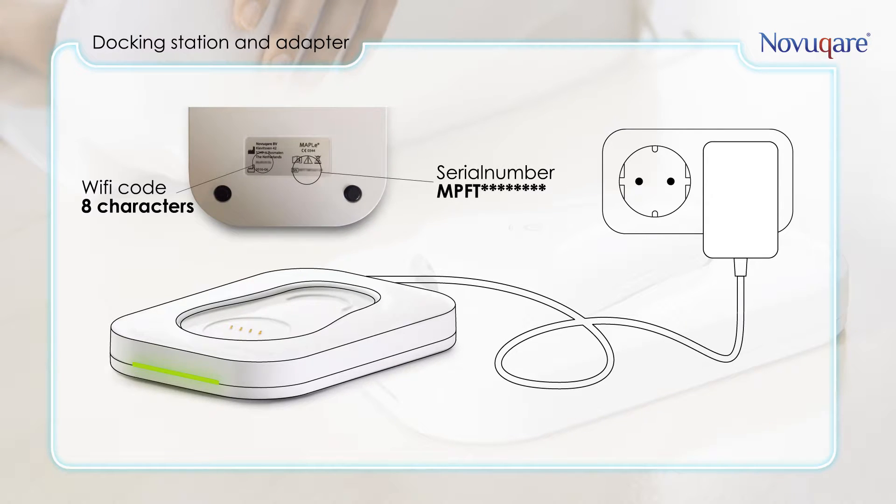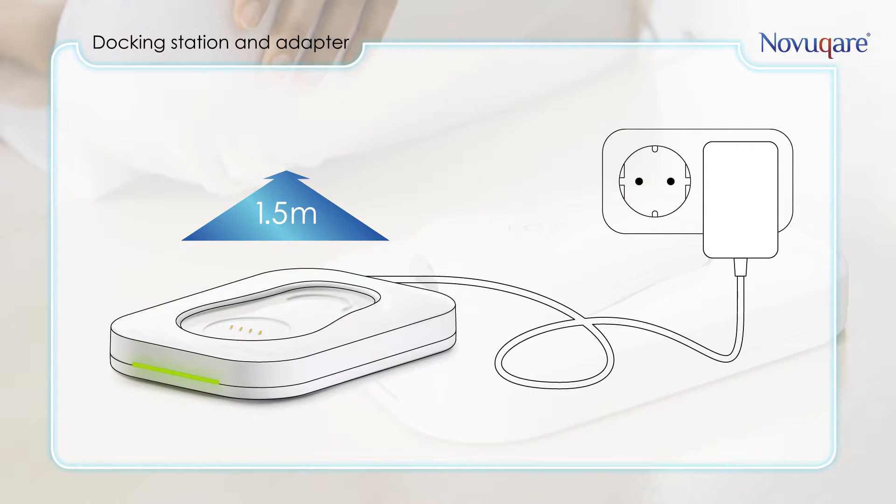The name of the Wi-Fi is the serial number of the device and can be found on both the back of the docking station and the handheld. It starts with MPFT. The password is provided on the back of the docking station below the NovaCare address. For patient safety, the docking station should be at least 1.5 meters away from the treatment area.